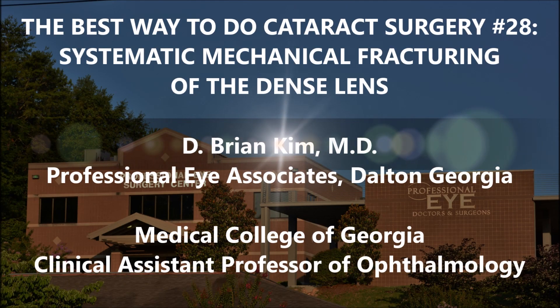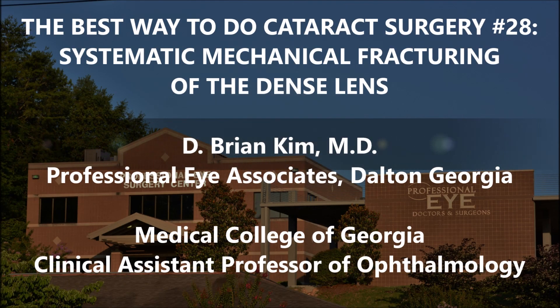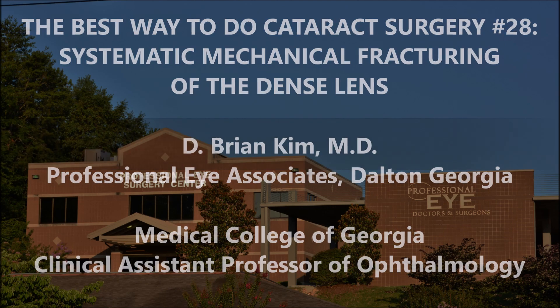Hi, this is Brian Kim. I'm going to share with you case number 28 in the best way to do cataract surgery series. This is a dense lens and I'm going to show you systematic mechanical fracturing, double chop, cross chop. I'm going to show you how I'm able to use and leverage mechanical fracturing forces instead of using ultrasonic energy to break up the lens pieces, using the chopper to mobilize the lens pieces and trying to reduce zonular stress. For these reasons I feel like this is a safer and better way to do cataract surgery.